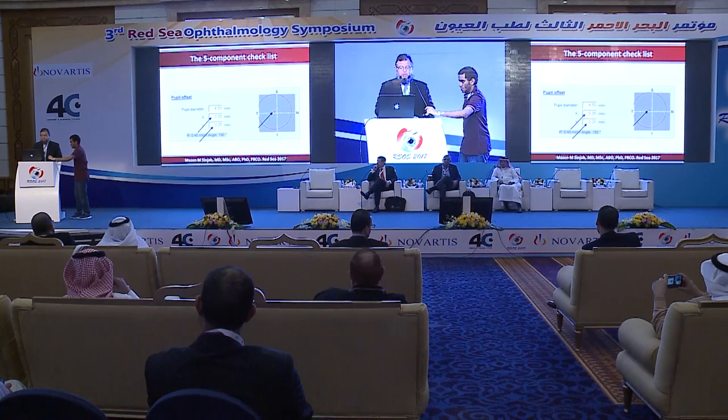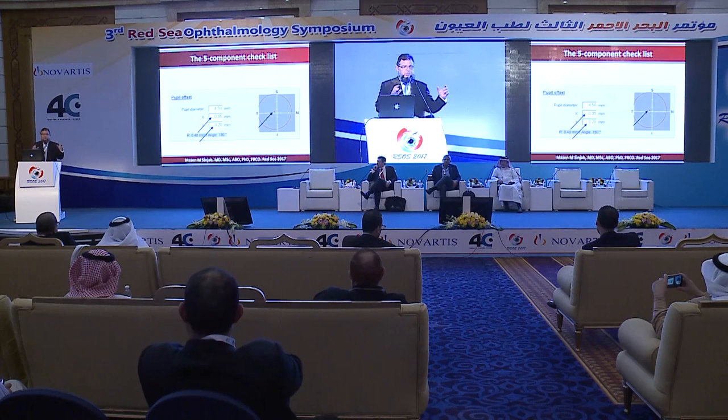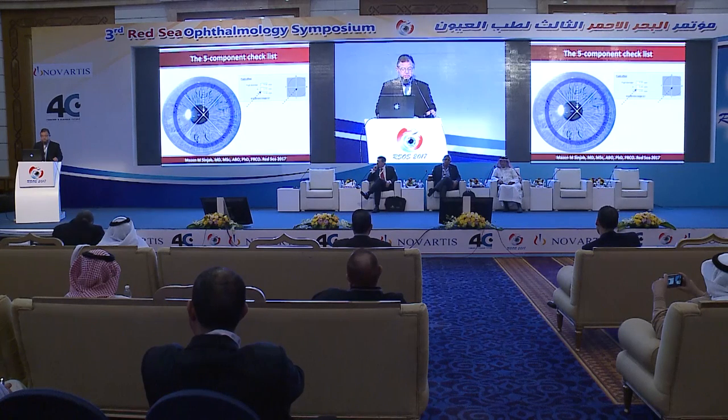You all know what angle kappa is, and it is usually measured by Placido, but if I have Pentacam and I don't have Placido, very roughly I can say angle kappa is 50% of the Y and X coordinates of the pupil center. Then I enter the values in order to shift, as you see here. This is when I leave it without shifting, and this is after shifting. In this case, I am centering the ablation profile with the visual axis.